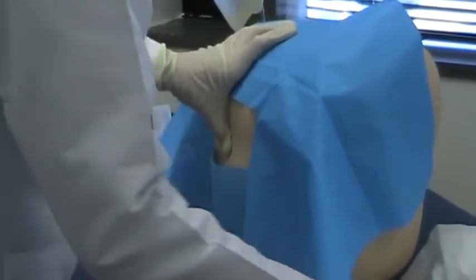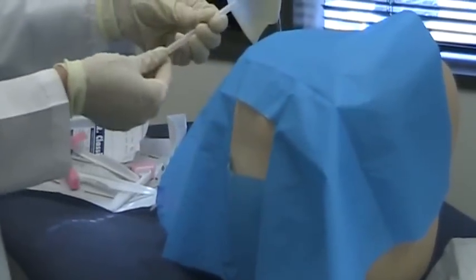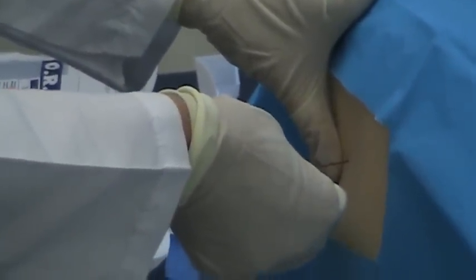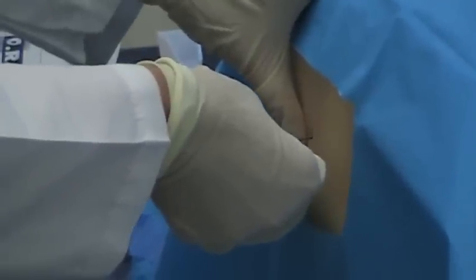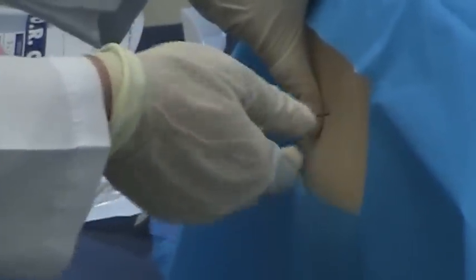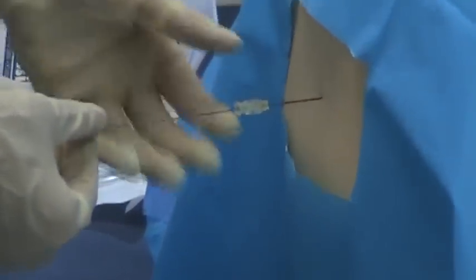Now that the patient has local anesthetic, we start introducing the LP needle in the correct direction — cephalic and parallel to the bed. I felt a little bit of resistance and then a sudden give, like looseness, which suggests I am in the intrathecal space.